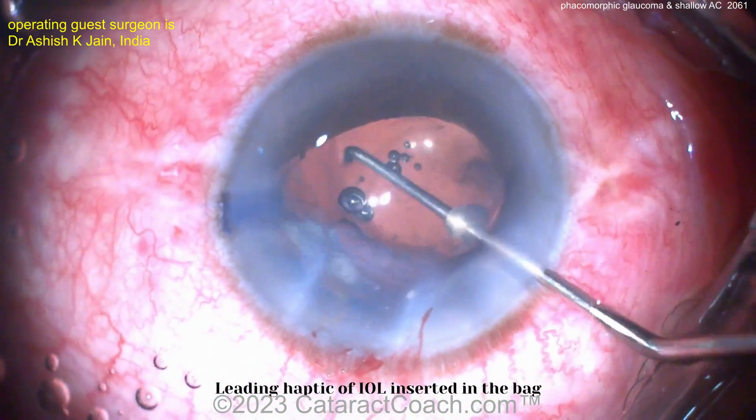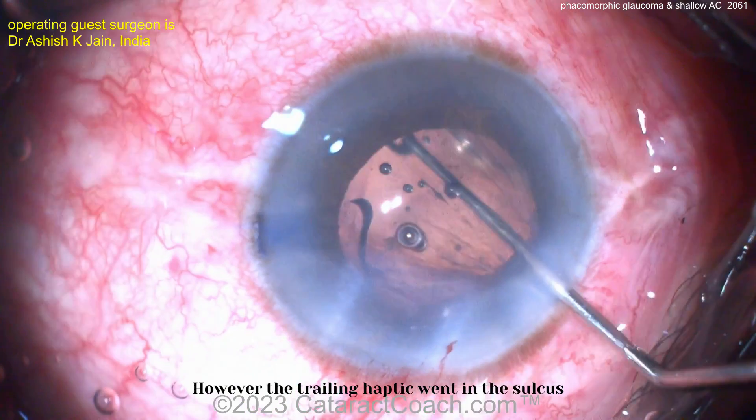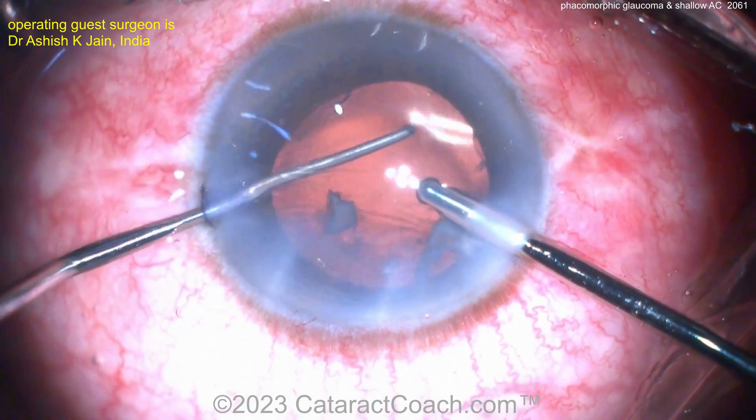Here comes the lens — a single-piece lens going into the capsular bag. Nicely placed. Still a little bit of lens material to remove, which can be done very easily. Getting that out — oh, the trailing haptic ended up in the sulcus, and now pushing it back into the bag.